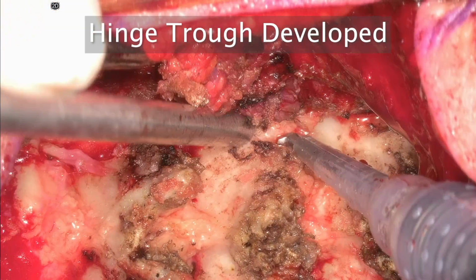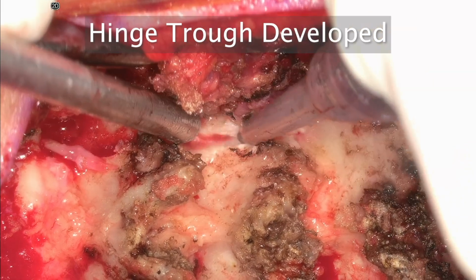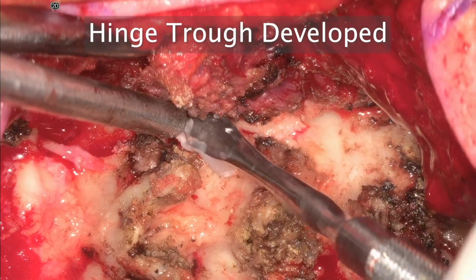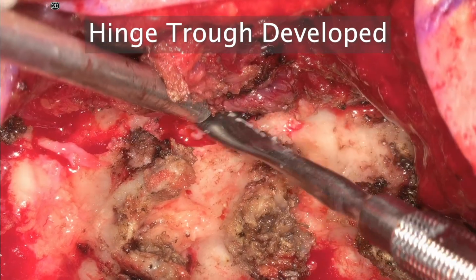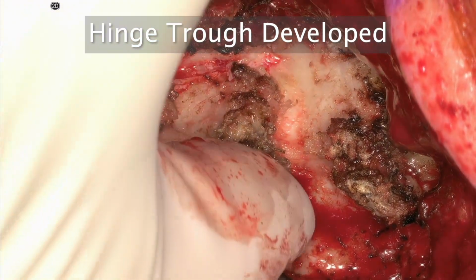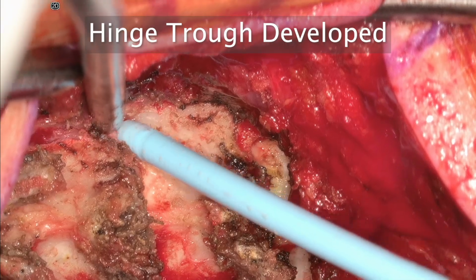It's important to remember that these lamina are three-dimensional. They have a ventral cortex, a cranial and caudal cortex, and a dorsal cortex. Really, we're taking away all except for the ventral cortex. That's really the most important thing. If you don't release that cranial and caudal, you'll never be able to elevate the lamina like this and get that green stick.